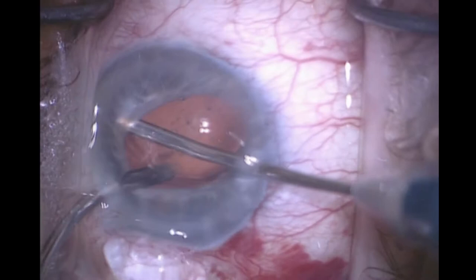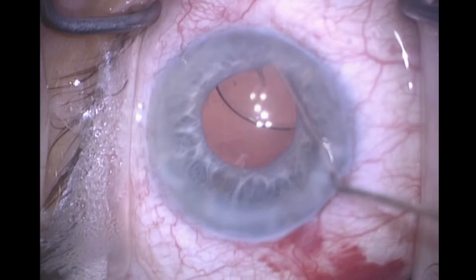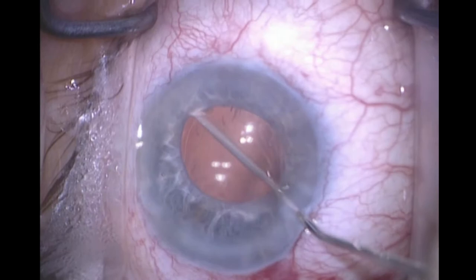I do want to remove some of the viscoelastic that's in the bag, because otherwise when I buttonhole the optic through the CCC it will trap the viscoelastic, and that will cause forward displacement of the optic and a myopic error. Now I rotate the lens so that the haptics will more or less be in the horizontal meridian.